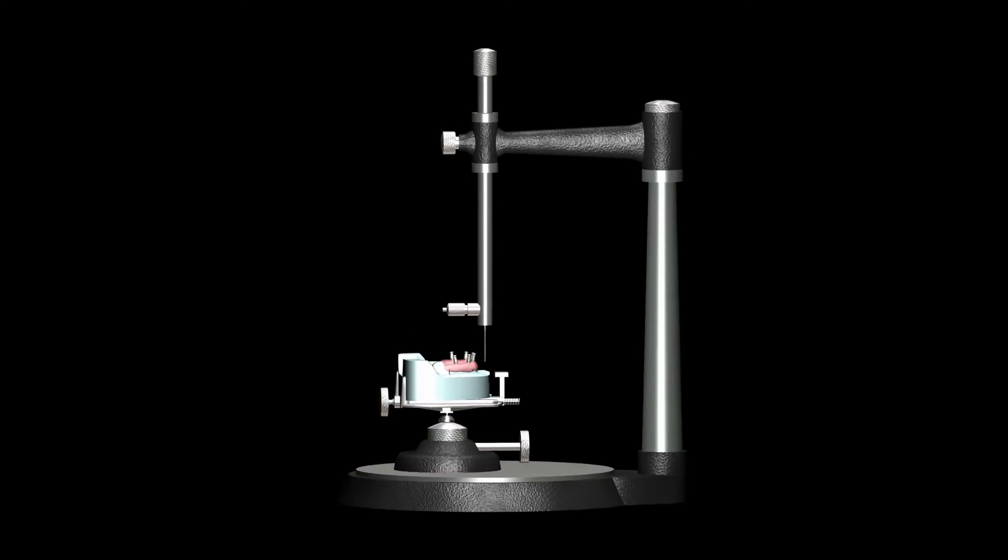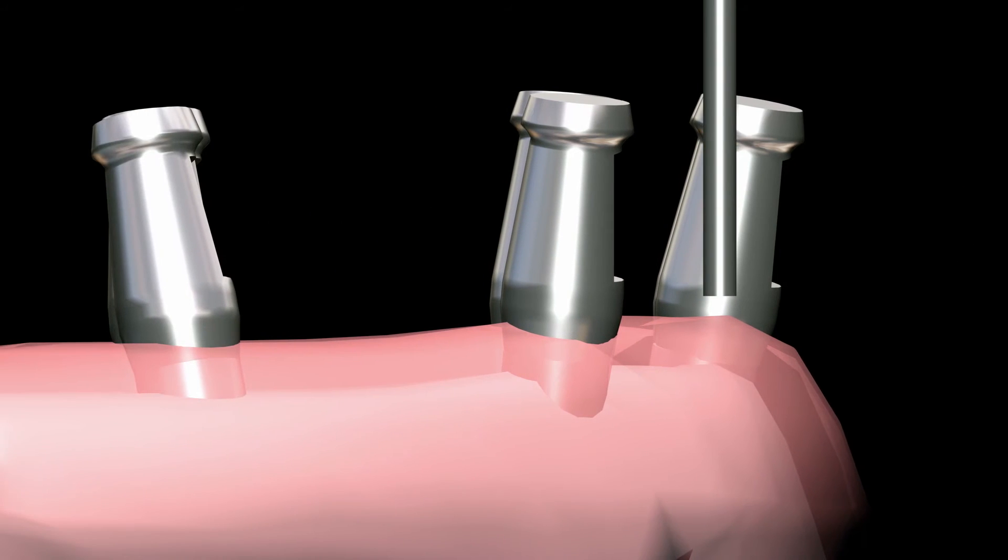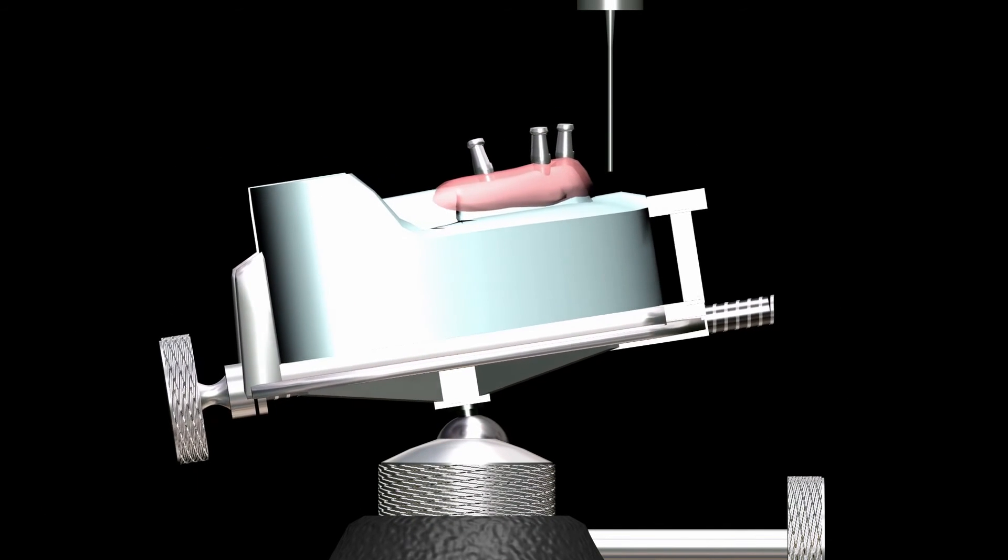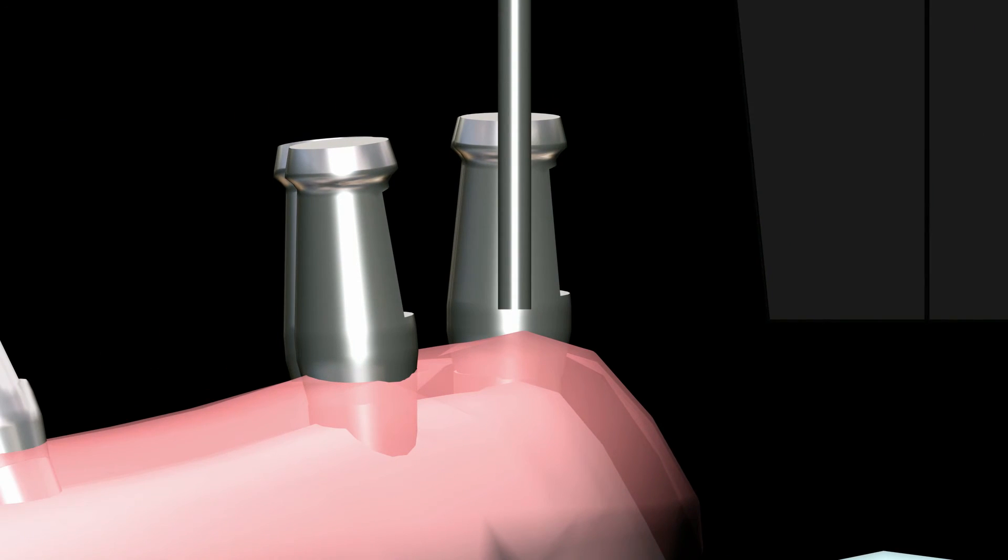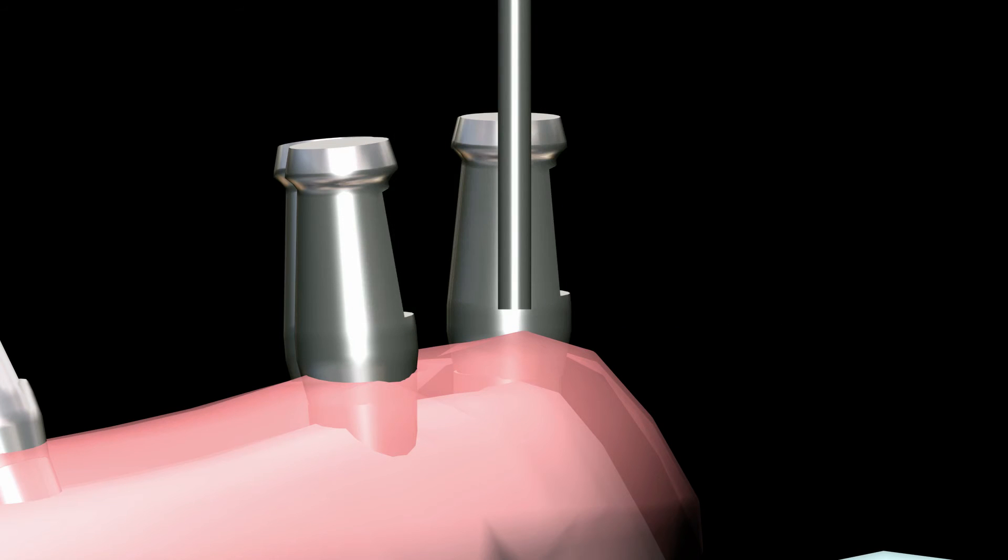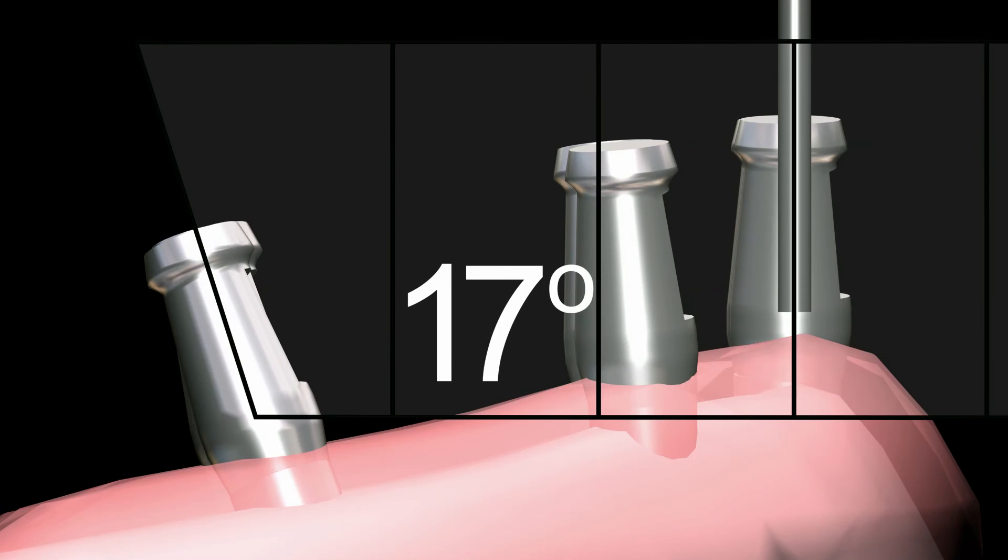The use of a dental surveyor is now utilized. Tilt the surveyor table to the desired path of insertion for the overdenture, considering the trajectory of the implants. Using a gauge, it is determined that in this particular case, the left impression coping is angled five degrees from the one on the right. The next one is angled by 17 degrees.